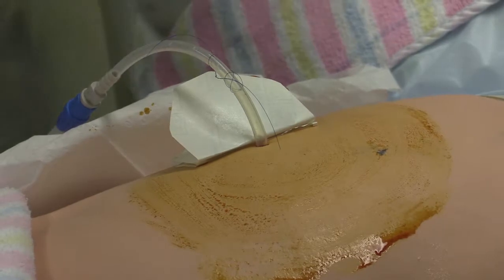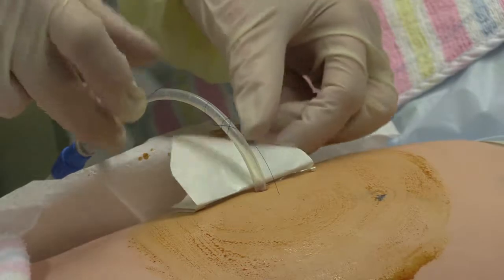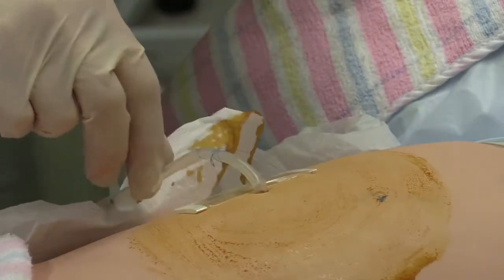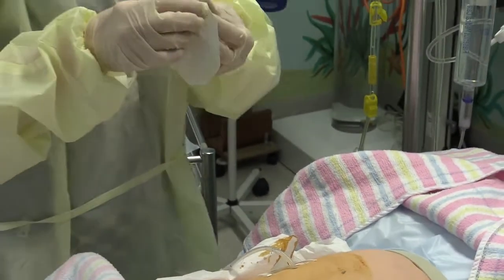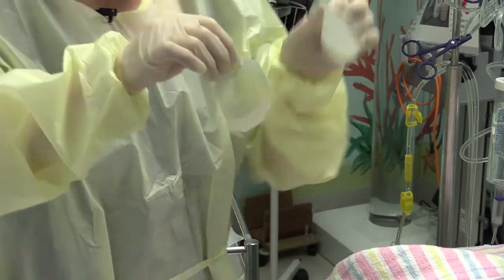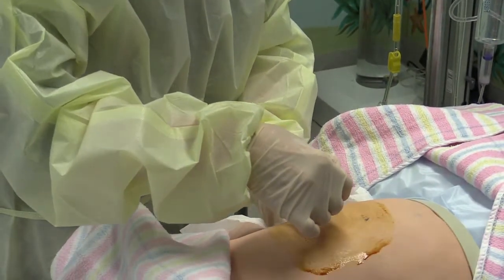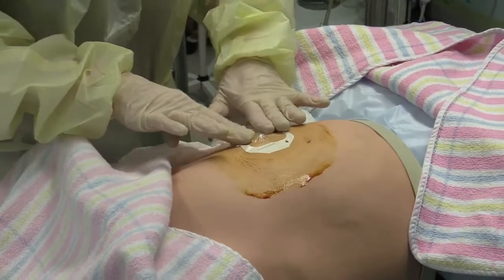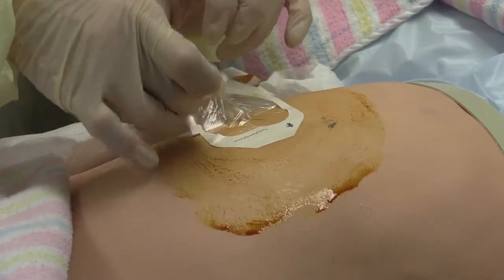Then the second small Tegaderm dressing will be placed flat over the top. So to do that, to make it seal, I'll remove the backing from the dressing that's already on the skin, and apply the second Tegaderm dressing after removing the backing, over the first dressing. Like that. Then I'll remove the backing.